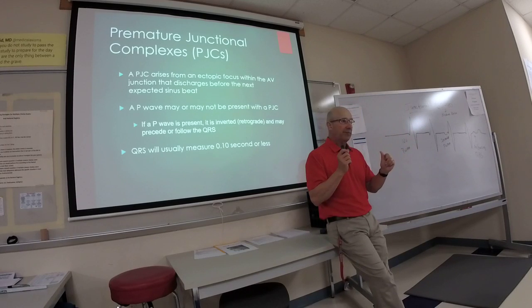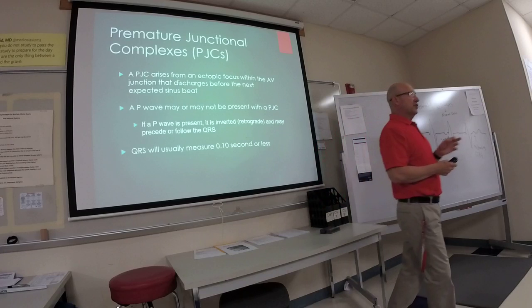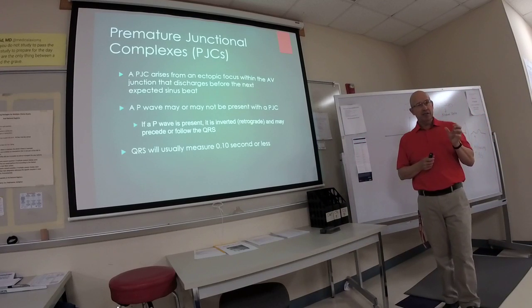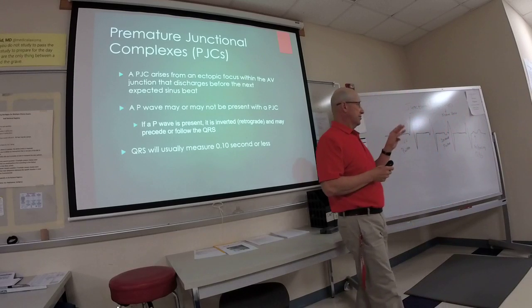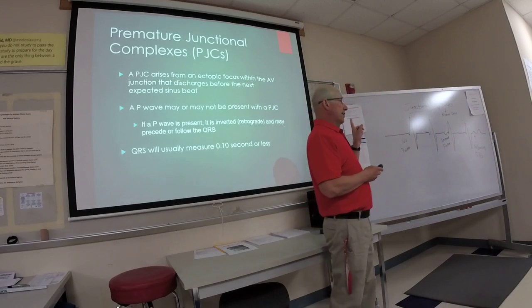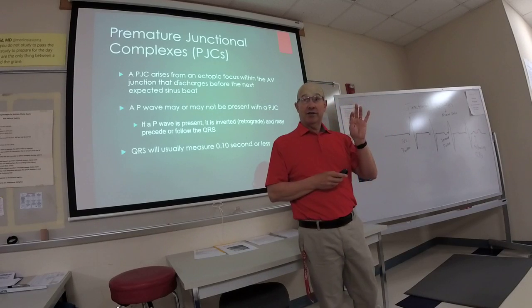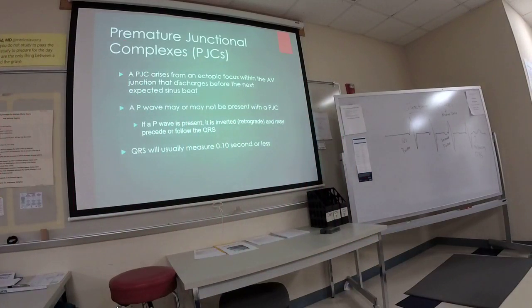Multifocal and unifocal will play a part in PVCs in a minute, where they all look the same. Unifocal means it's firing from the same focus, or the same cell. Multifocal means it's firing from different cells. So that atrial beat is going to look different. Remember that part?